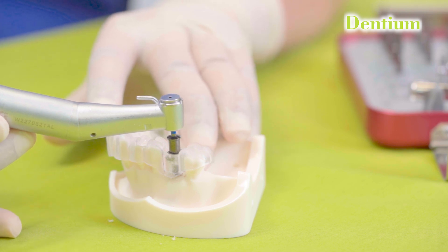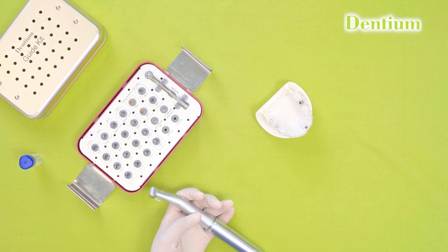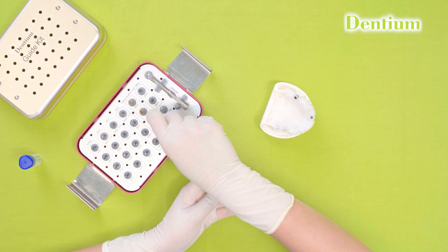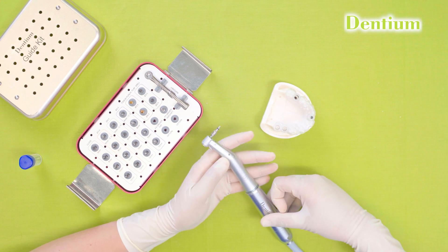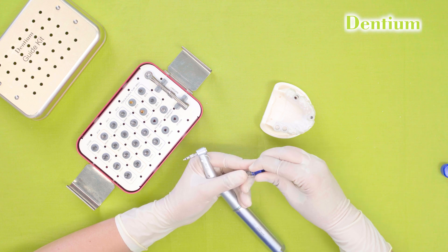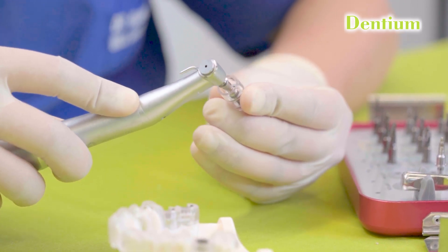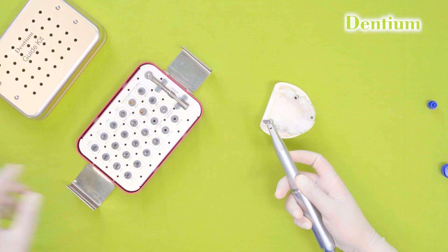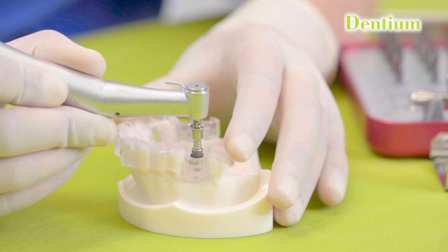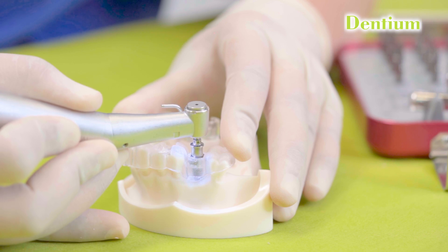The 4.5 by 10 mm drill will also be inserted till the full depth. Now I will change the ICT motor settings to implant placement. The speed for implant placement is maximum 50 rpm and the torque will be 35 Ncm. I will be placing a 4.5 by 10 mm implant, picking it out from the implant box and inserting it through the surgical guide. This step is done without irrigation, whereas the drilling process has to be done with copious irrigation. I will slowly insert the implant inside and let it go smoothly.